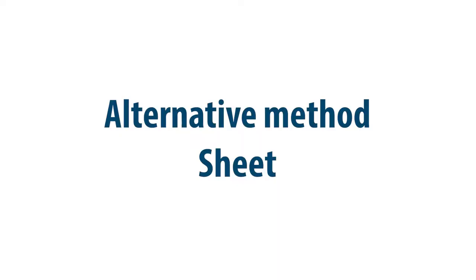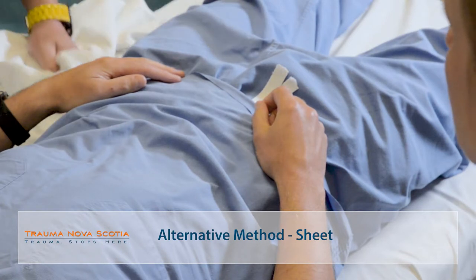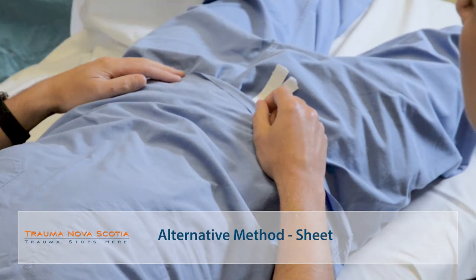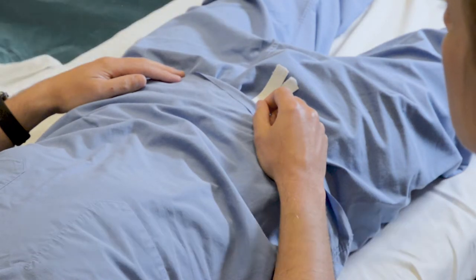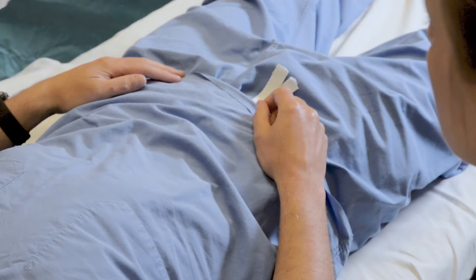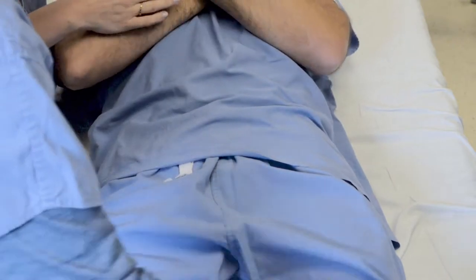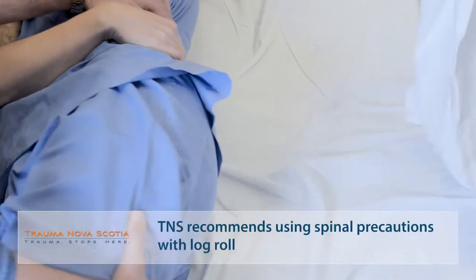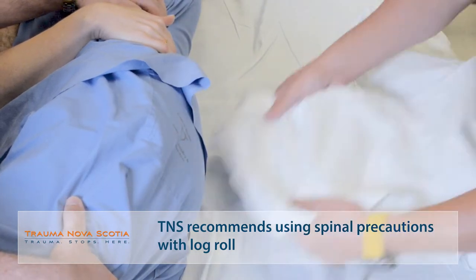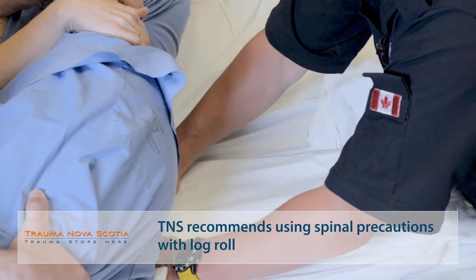We're going to show you an alternative way to bind a pelvis. If your facility doesn't have a T-POD binder, you can use a hospital sheet with four clamps. We'll go through the process of log rolling the patient towards Jason and Liz on Sam's count, and feed the sheet — which is folded — in the area over the pelvis.